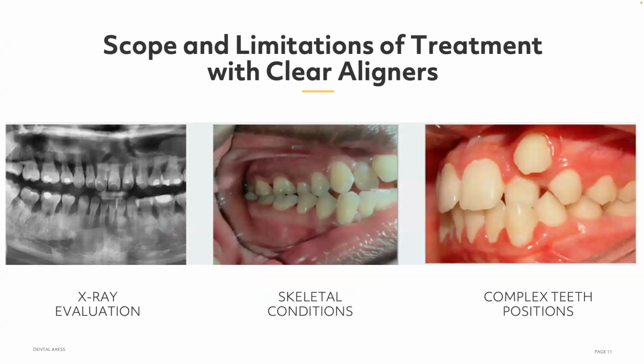Now we have the scope and limitation of treatment plans with clear aligners. This is also very important to understand, at least the basic knowledge, because we need to see first if our patient qualifies for a treatment plan.